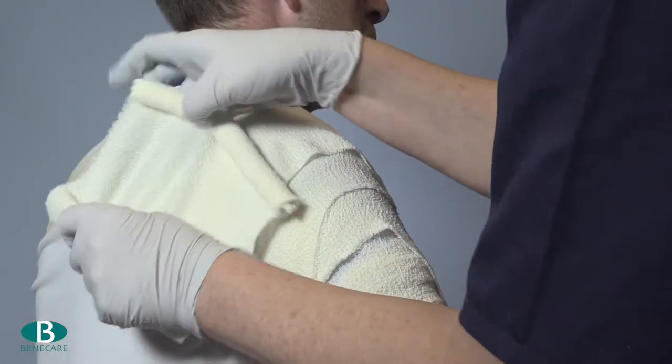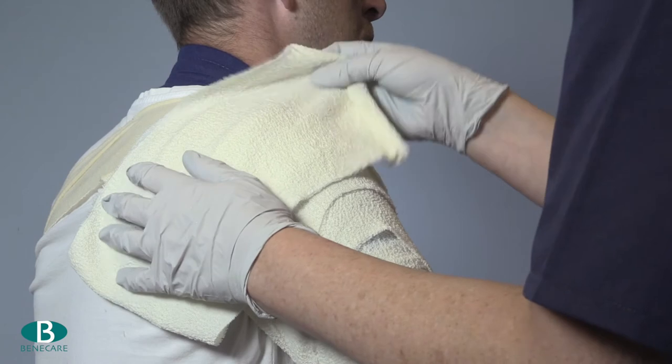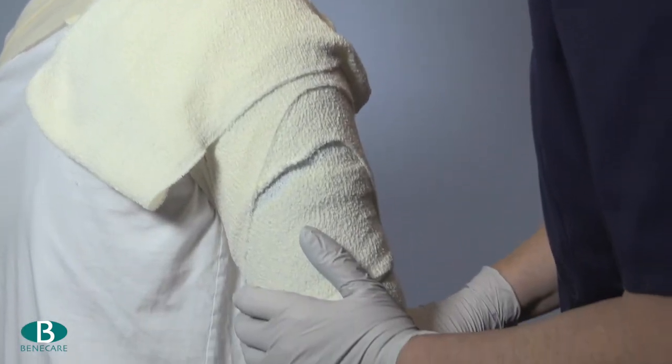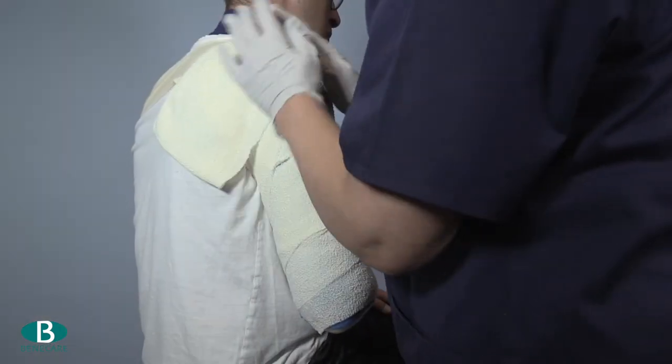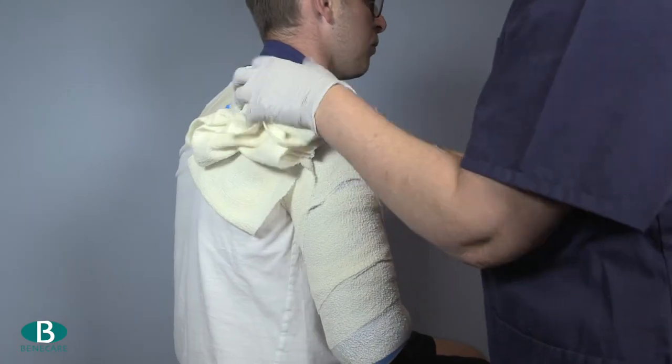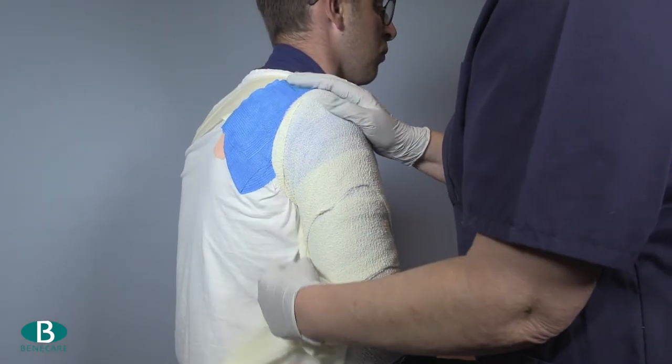Ensure the patient is relaxed and then mold the brace onto the limb, paying particular attention to the glenohumeral joint of the shoulder and the distal aspect of the brace, to ensure the brace fits to the contours of the limb and provides excellent compression.